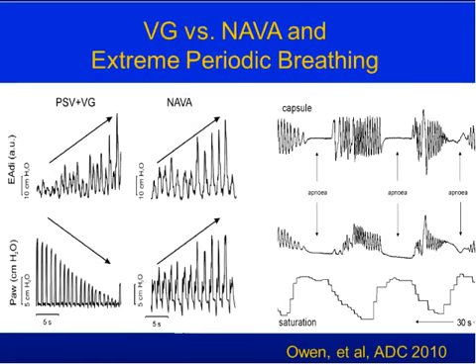You can see on the left there is very little effort, and therefore the pressure generated by the ventilator is high. The ventilator compensates for lack of effort to try to keep the tidal volume stable. As the baby breathes more and the tidal volume exceeds the target, the pressure will drop to avoid exceeding the target tidal volume. That makes a lot of sense for premature babies who have a very irregular respiratory pattern, as seen on the right.